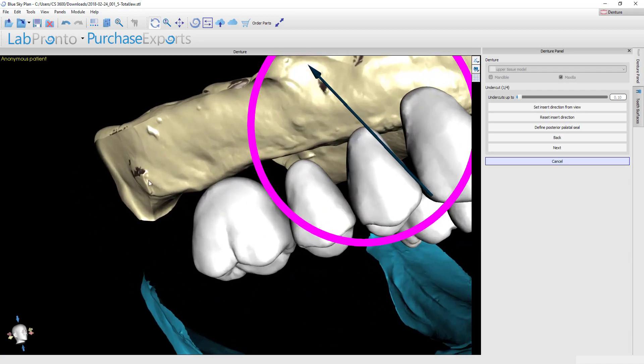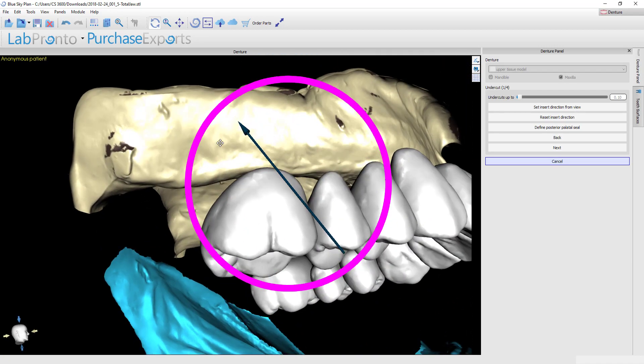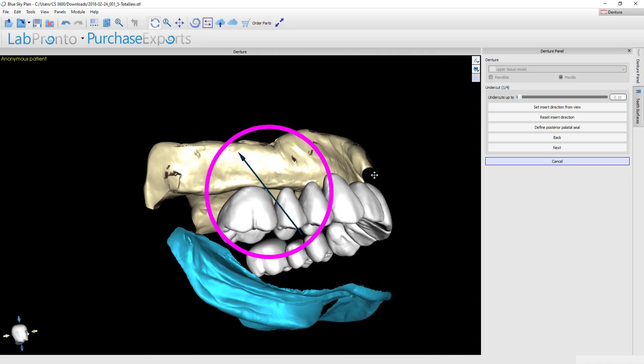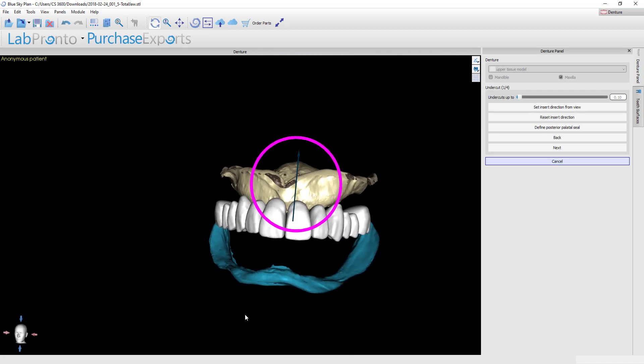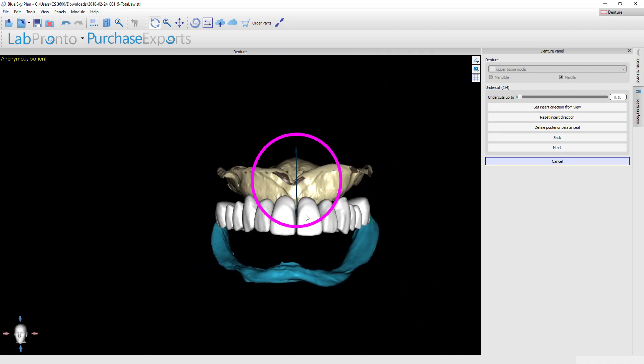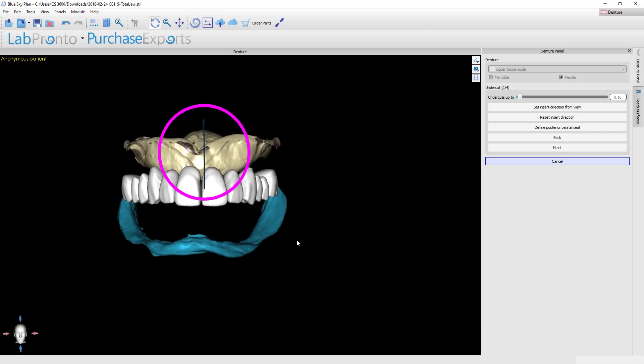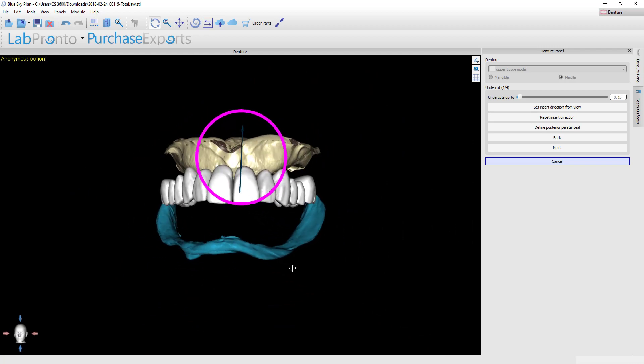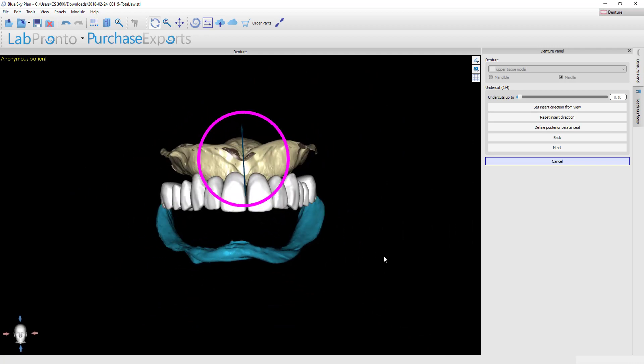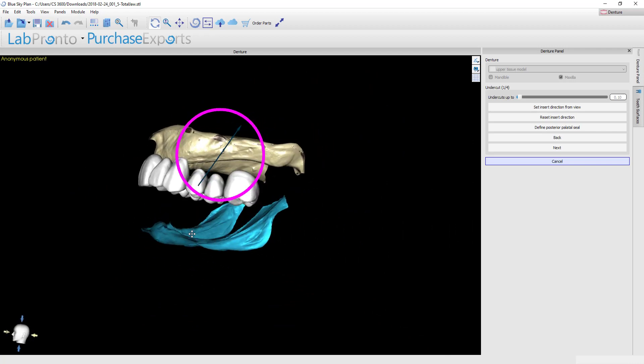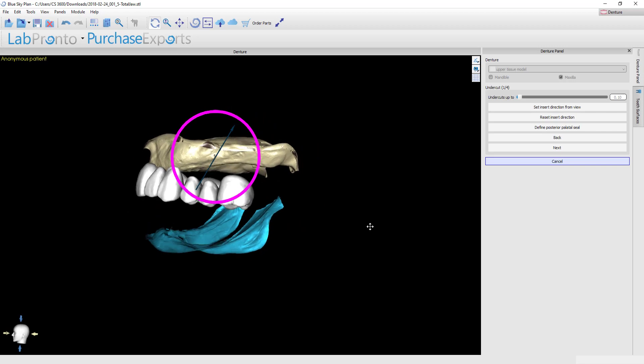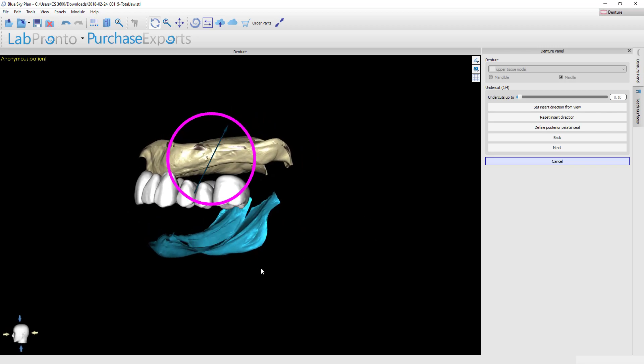There's still just a few little areas but not really much to worry about. Try to optimize your path of insertion so that you've got the least amount of undercut possible. But with that said, you need to ask the question: do you want the software to block out undercuts or not? There are different scenarios where you would do both of those options.